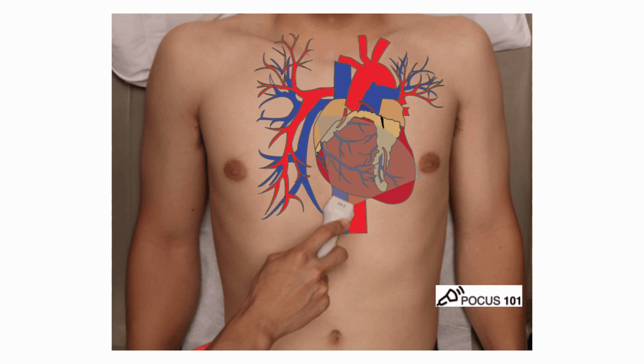So before I talked about needing really deep measurements on this, usually around 20 to 24 centimeters, is because you really have to penetrate a lot of tissue. Now, liver also helps because it has some fluid-filled components. It actually helps as what's called an acoustic window. It actually intensifies your ultrasound signal. But really, you want to be holding the probe like the person is here in the picture. You want your hand on top of the probe, and that actually allows you to push in and kind of sink the probe up under the rib cage and point up towards the heart.